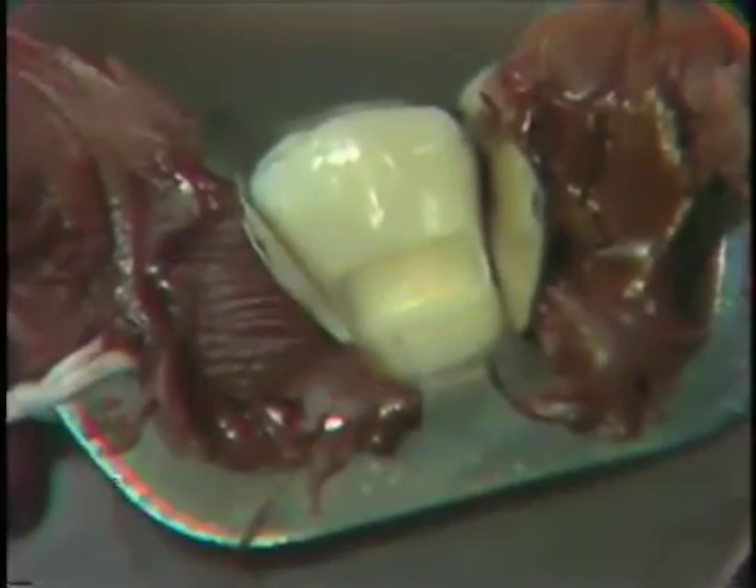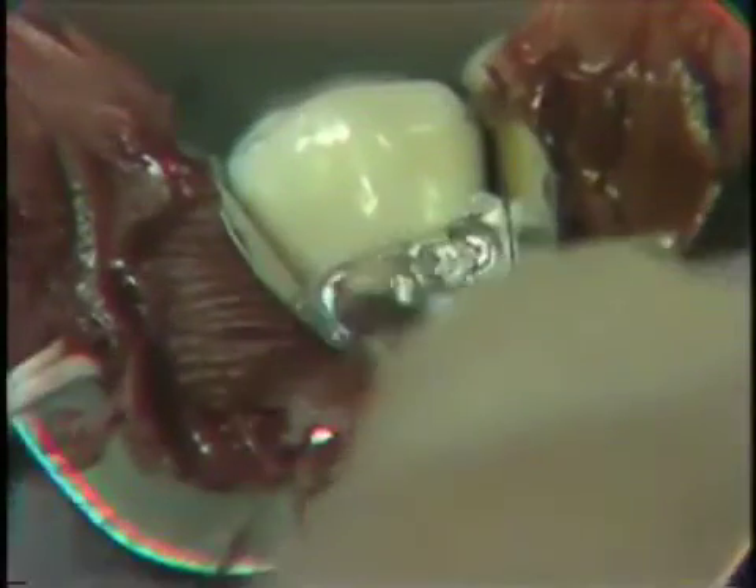The sequence and packing is similar to the other class V that you saw. We will add amalgam and pack into the cervical retentive areas first. Using our Wesco condenser, and now with a matrix in place, we can pack against this matrix, packing at the cervical area into that cervical retentive groove.